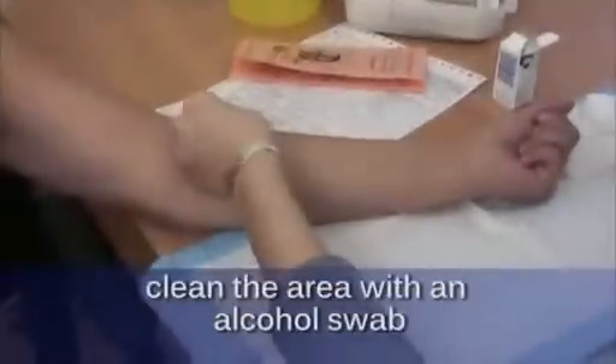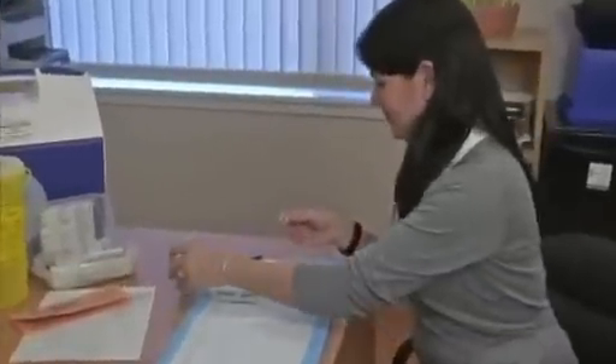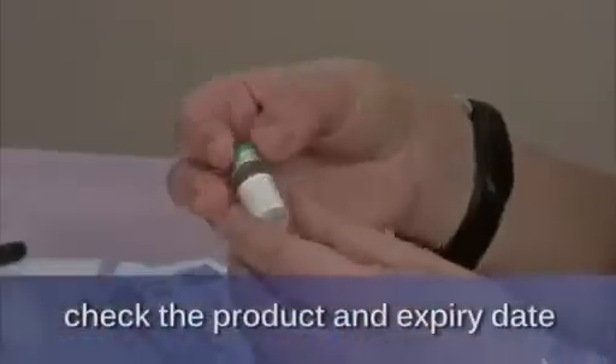Clean the area with an alcohol swab. Examine the PPD vial, checking for product and expiry date.